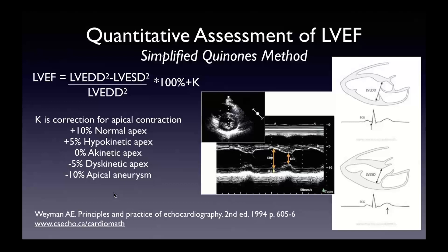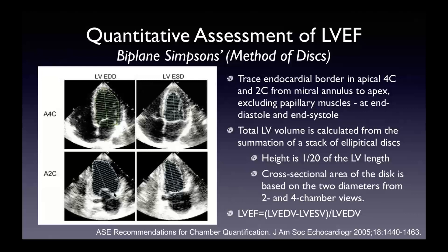The Simpson's biplane method — also known as the method of discs — from the ASE quantification guidelines: you trace the endocardial border in the apical four and two-chamber views from the mitral annulus, around the walls, tracing the endocardium all the way to the apex and around it. You want to exclude papillary muscles and trabeculations. You trace at endocardium to endocardium. The total volume is calculated from the summation of a stack of elliptical discs.